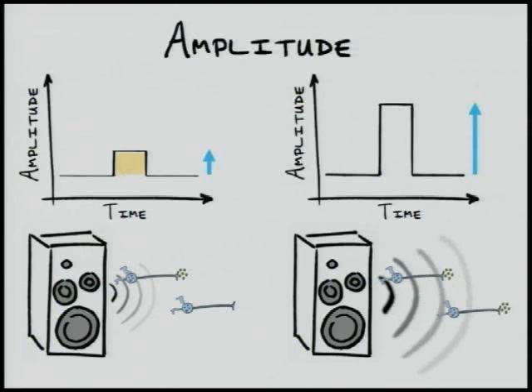Lastly, keeping in mind that the area below a stimulation waveform is related to the amount of charge pumped out by a neurostimulator, it is clear that a low amplitude signal, compared to a high amplitude signal, pumps out less charge per waveform, as indicated by the areas shaded in yellow.